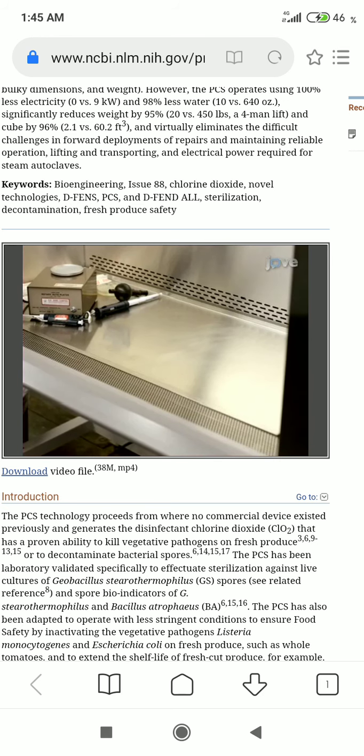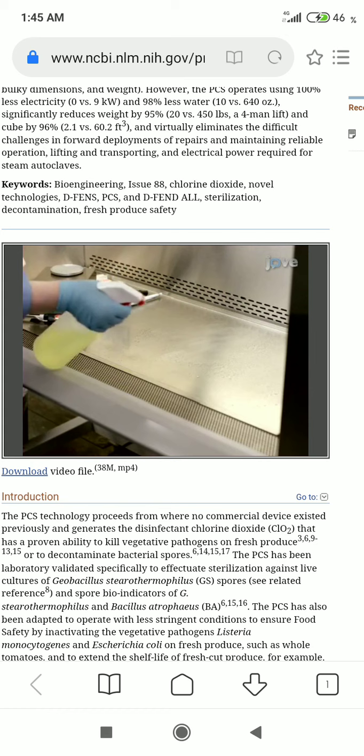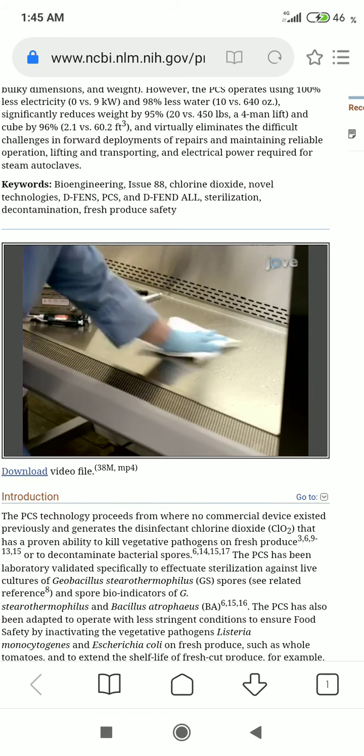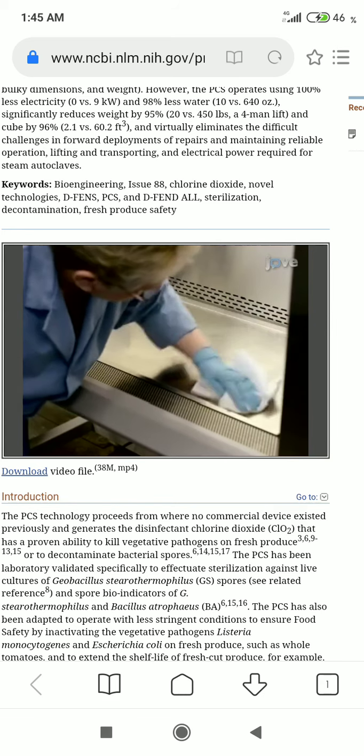Dispense the disinfectant solution by spraying as a fine mist or aerosol, sanitizing the contaminated target surfaces. The chlorine dioxide solution of Defend remains stable for an 8-hour shift.